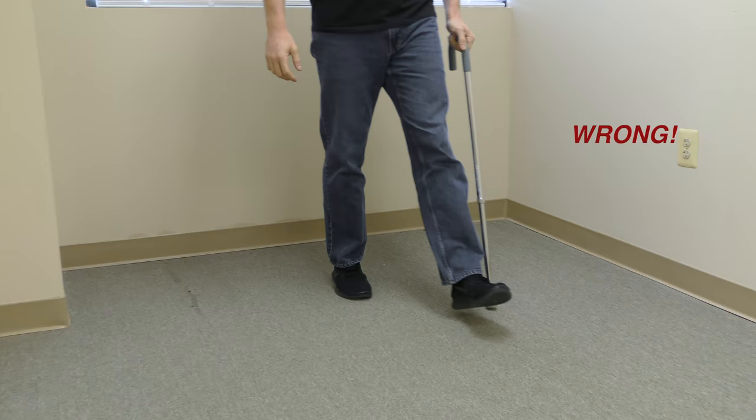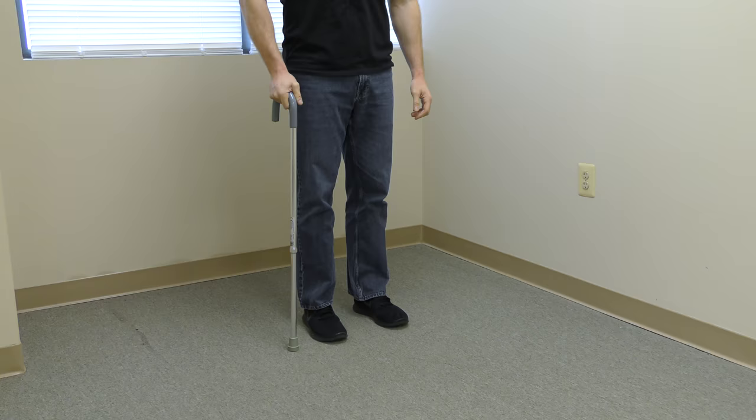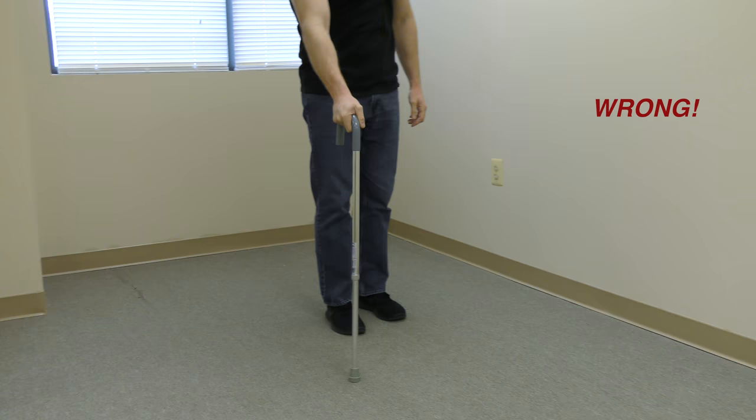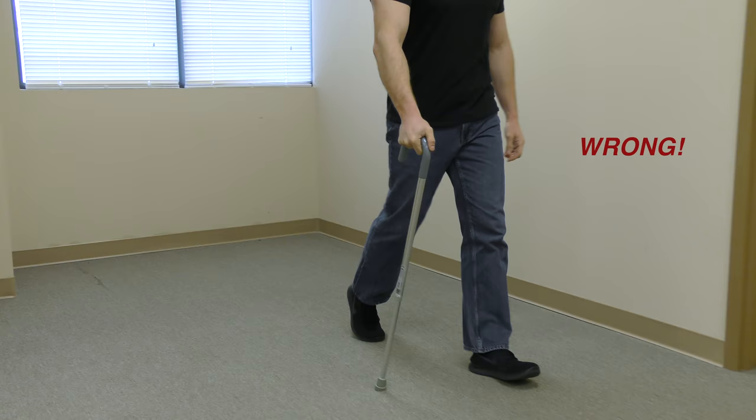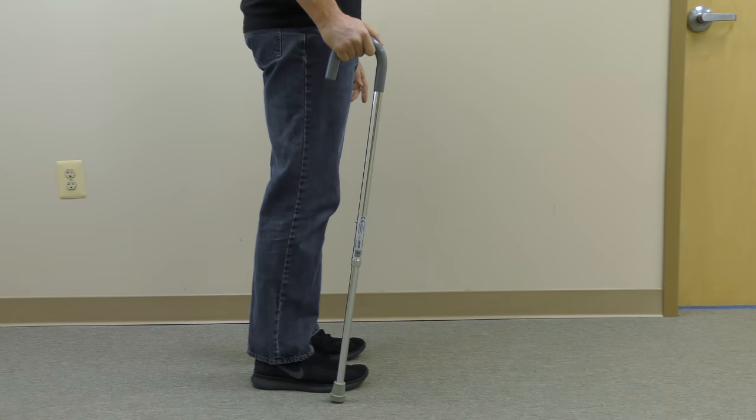This is not correct — the cane is now on the same side as the involved side. This is also not correct: the cane is in the correct hand, but it is not moving together with the involved left side. Again, not correct — the angle of the cane and the angle of the involved side should be the same.